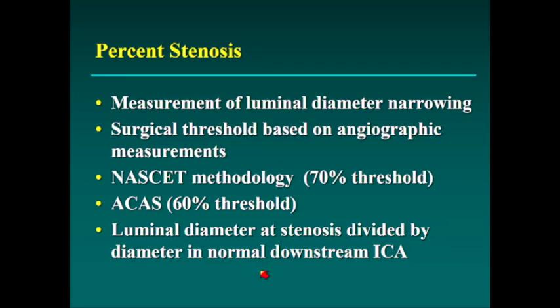We don't tend to measure diameters of stenosis, but there has been some enthusiasm for something called the minimal residual lumen, or measuring how much there is left. And if I remember correctly, if it was 0.6 or below, that indicated critical stenosis.